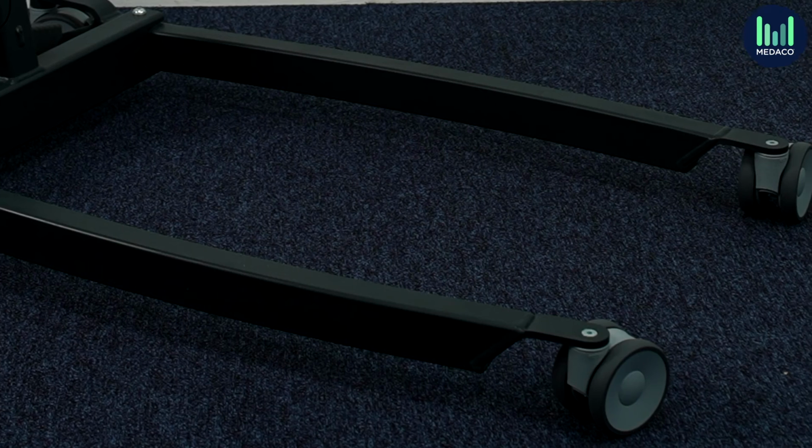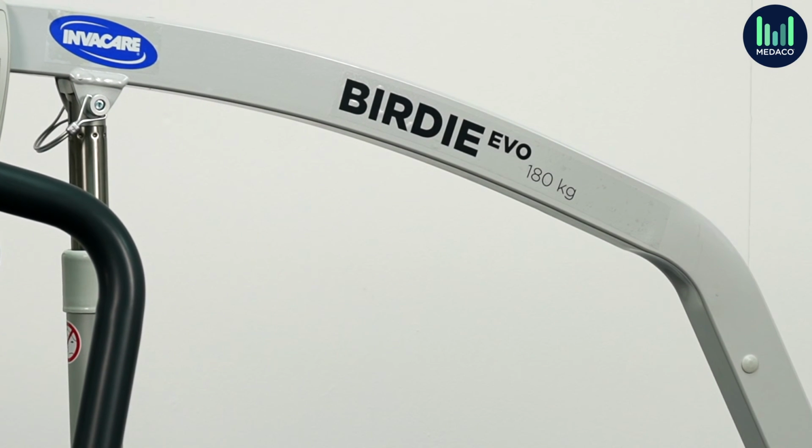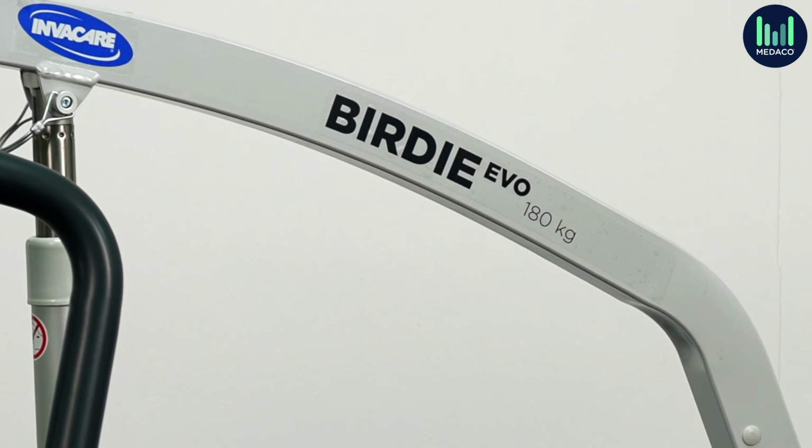Another common cause of breakdowns from mobile hoists is damage to the legs or frame. There are several causes of this which unfortunately usually occur through incorrect use. This can happen if the mobile hoist is slammed against furniture, the equipment is overloaded past the safe working load, or if the sling gets caught around the leg during a transfer from the floor. Providing your staff with training on the correct use of equipment will help to reduce call-outs associated with the issue.